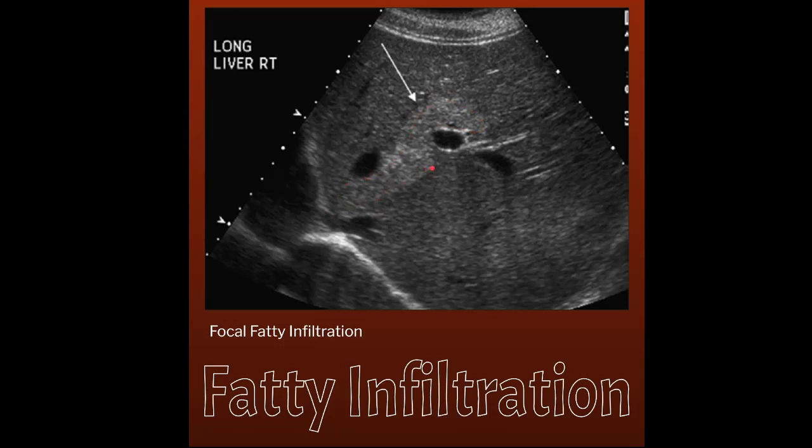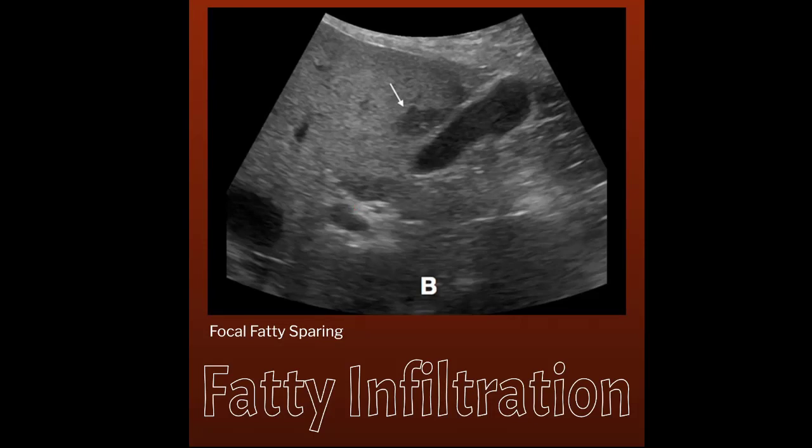Now it's important that we do take pictures of this. Maybe I would probably measure it, put some color on it, because we can't know for sure, is this some sort of abnormal tumor versus fatty infiltration. So we still want to make sure that we are working it up in the same way that we would any pathology.